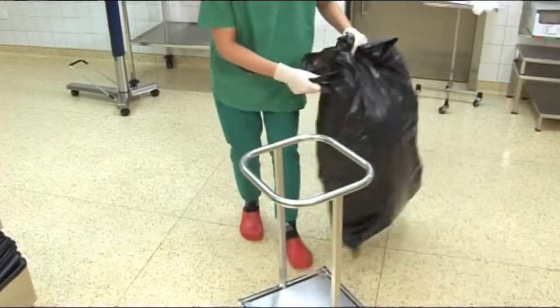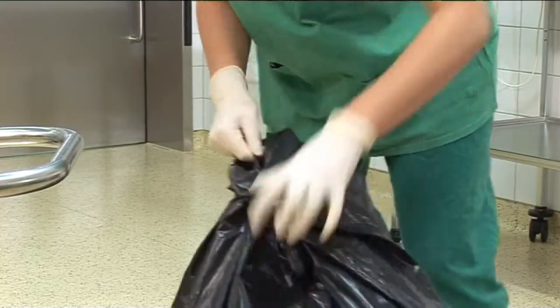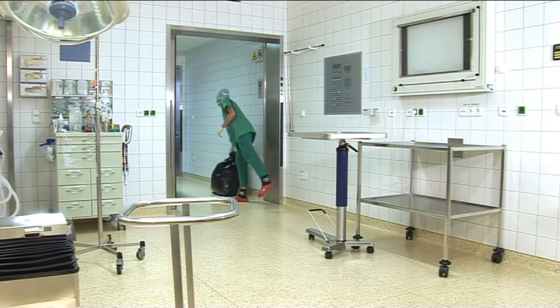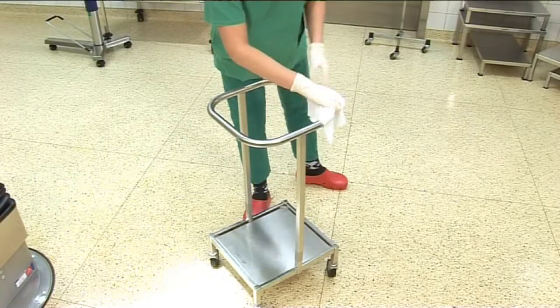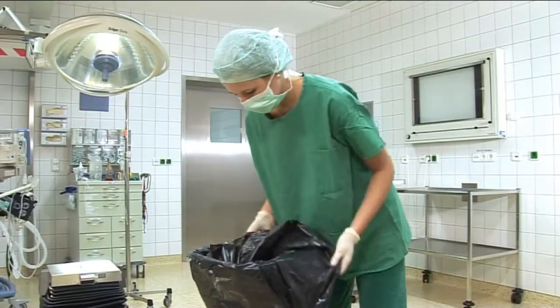Waste containers are to be emptied and sealed whilst still being in the operating theatre and made available for disposal afterwards. In addition, waste containers must also be wet cleaned and disinfected from the inside and the outside, as well as the rolls, during the final disinfection.